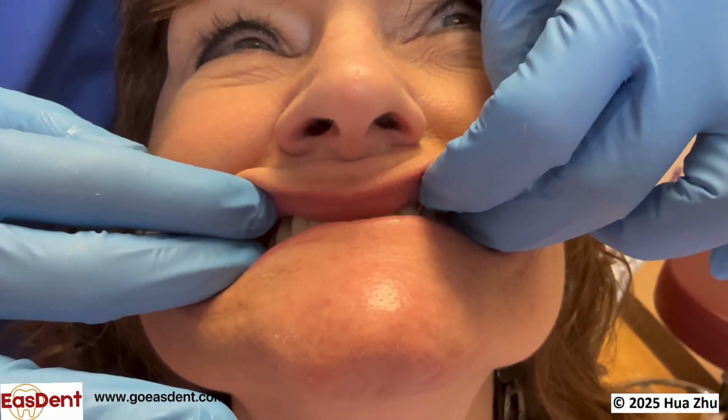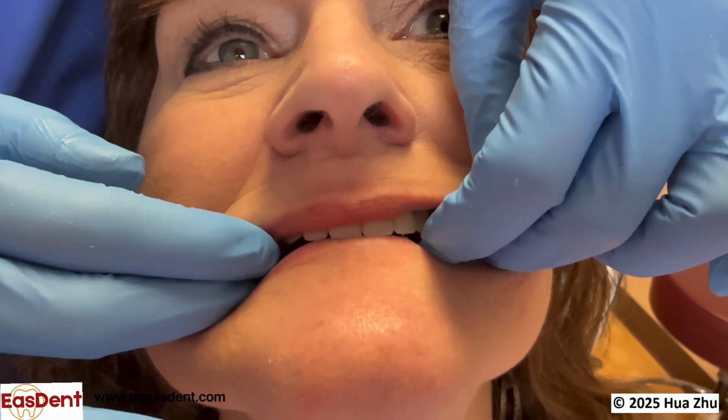Ask the patient, are you comfortable with the bite? Does the bite feel even on both sides? Do the denture or jaw shift when you bite down? Check whether the patient's most stable bite position is in centric relation.